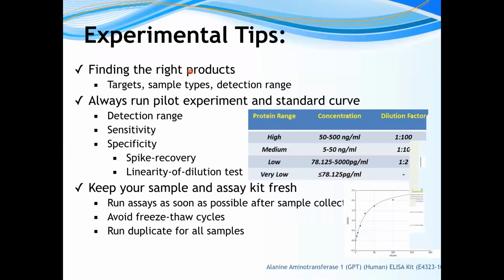Using an incompatible kit is just a waste of sample, time, and energy.